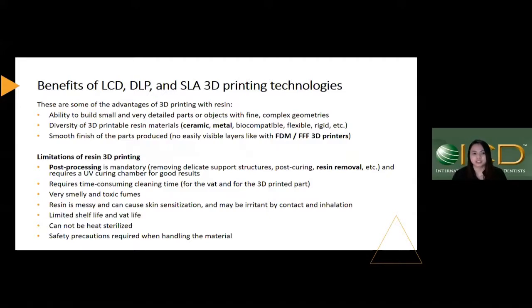But the limitation of these 3D printing types is that post-processing is mandatory. You have to do cleaning, post-curing, and resin removal. It also requires time for cleaning, with smelly and toxic fumes, and the resin can sometimes be messy and can cause skin sensitization. There's a limited shelf life. It cannot be heat sterilized, and safety precautions may be required when handling the materials.